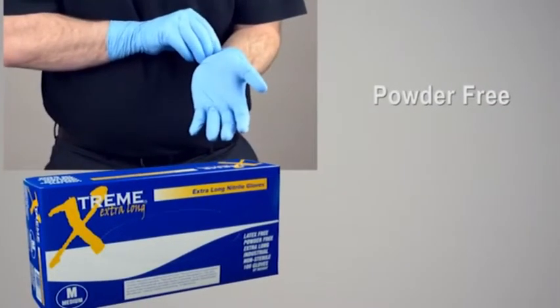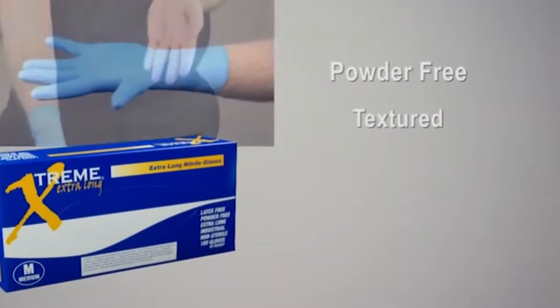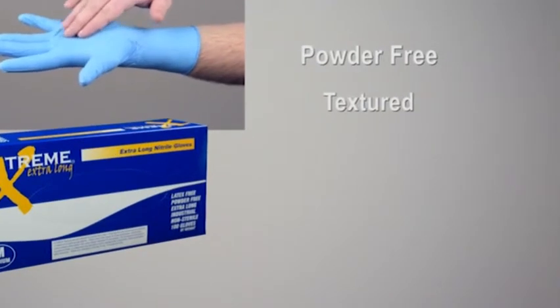It is powder free, so you don't have to worry about messy powder residue. The micro-roughing texture on the surface of the glove will give you an enhanced grip in wet or dry work environments.